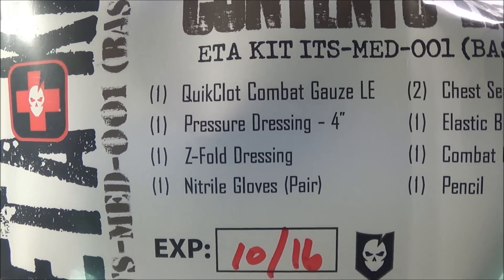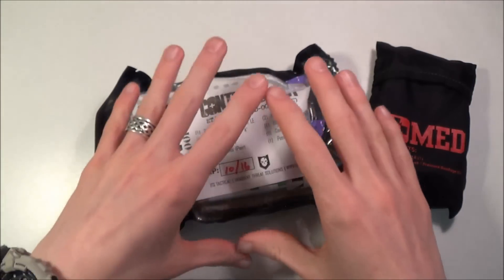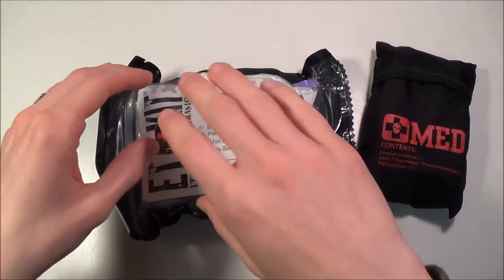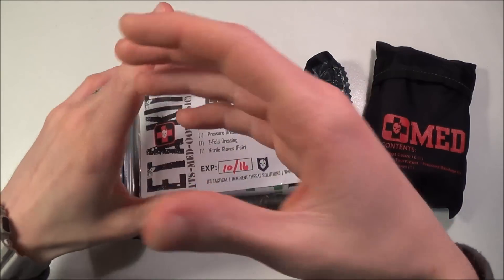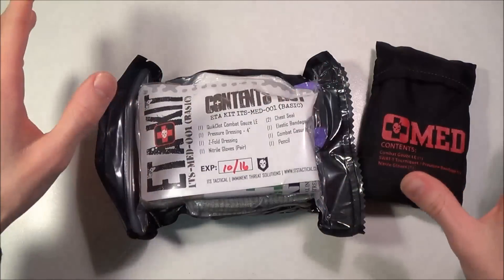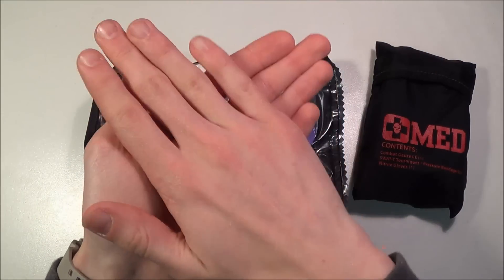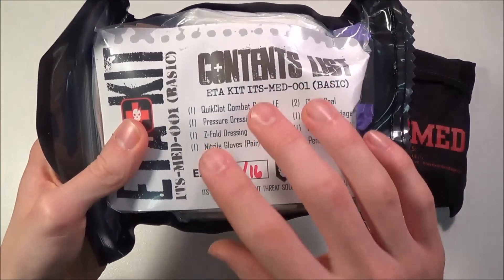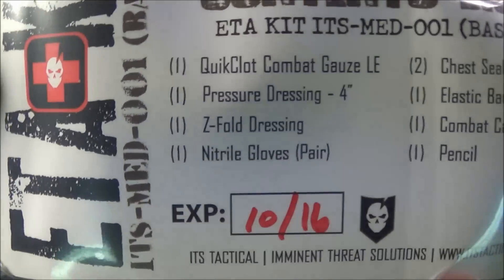You also get a four-inch pressure dressing, which is like an Israeli bandage, and a Z-fold dressing — a gauze pad that is not rolled up circularly but folded in a Z pattern. So if you drop it, it's not going to roll. That's the problem with rolled gauze and why the military doesn't really use them anymore. The Z-fold gauze is square and accordion-folds out, so if you drop it, it doesn't unroll and become unsterile. It's also much more compact. You'll also see S-fold gauze — same concept — and I highly recommend that kind of thing.